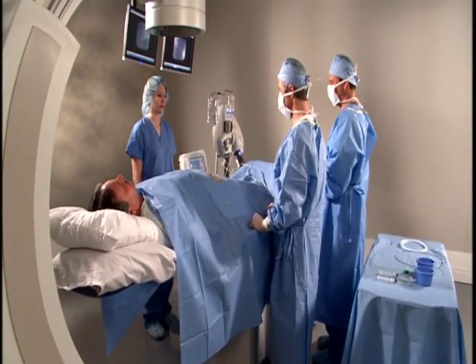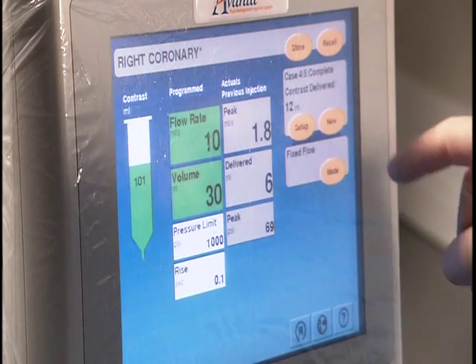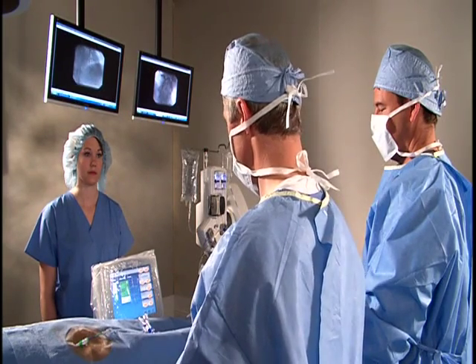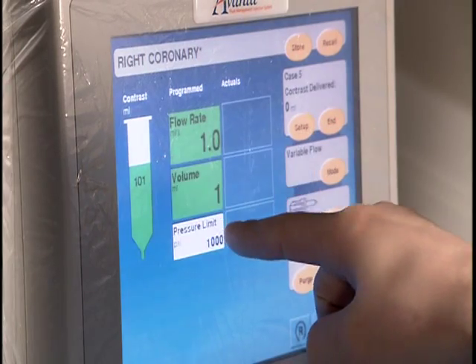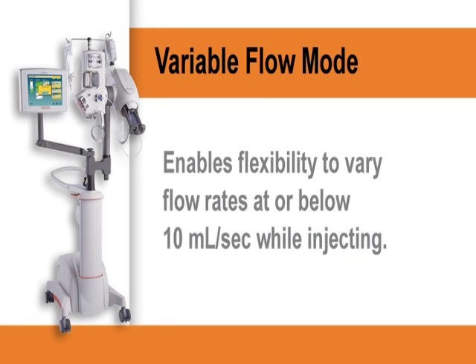To program the display control unit, verify that you are on the protocol screen. Confirm that you have selected a new case and that the contrast counter has reset to 0. Next, select your method of contrast delivery by touching Mode. You have the option of using either a variable flow or a fixed flow mode. The current mode is displayed next to the Mode button. Selecting Variable Contrast Flow Mode enables flexibility to vary flow rates at or below 10 milliliters per second while injecting.